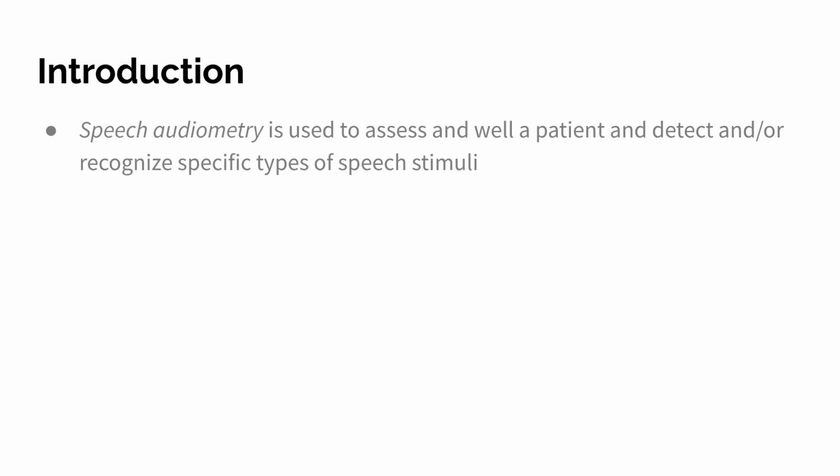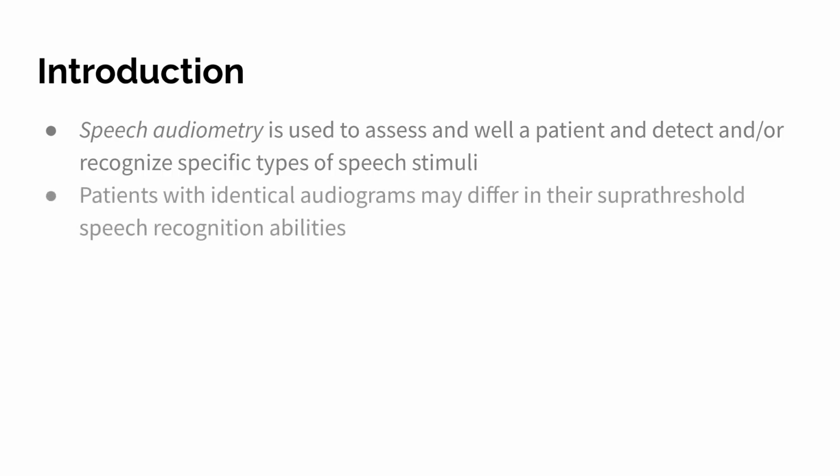So just starting off, introduction, what is speech audiometry? It is basically a type of audiometry used to assess how well a patient is able to detect and/or recognize specific types of speech stimuli. You can have patients with identical audiograms, but they might have differences in their superthreshold speech recognition abilities. Superthreshold meaning above threshold, so basically not at detection threshold like we have with pure tone audiometry, but superthreshold meaning at an audible level, like a conversational level as an example.